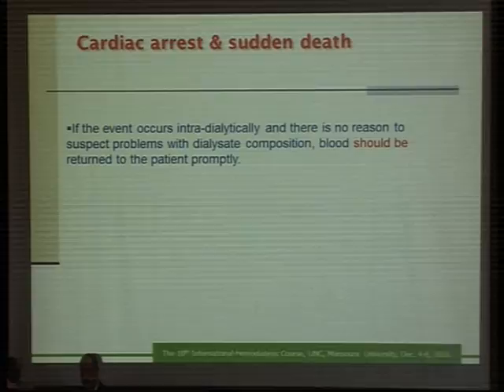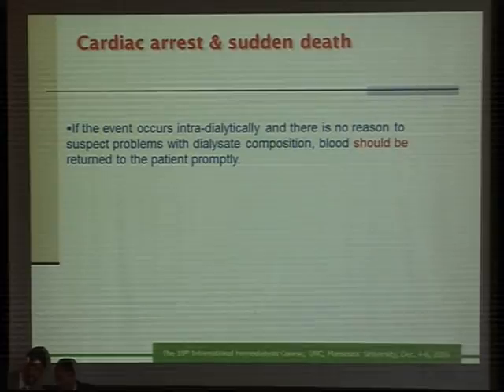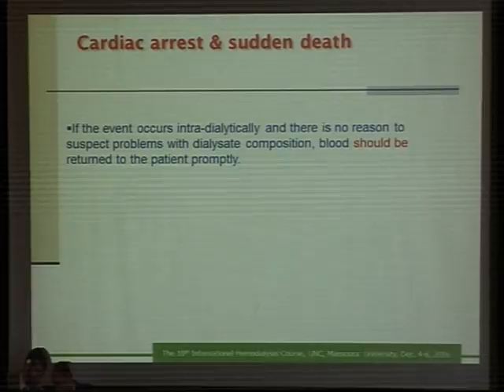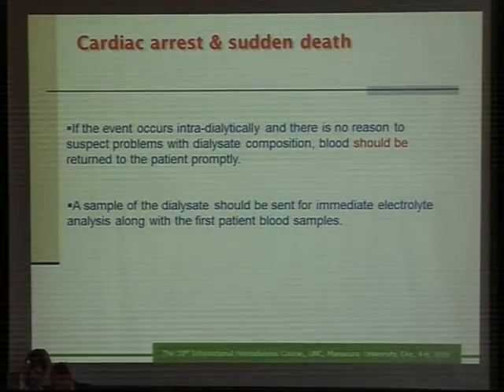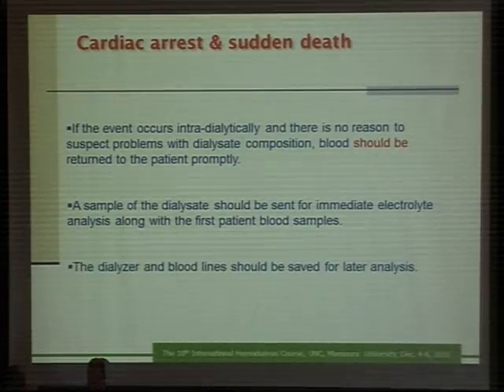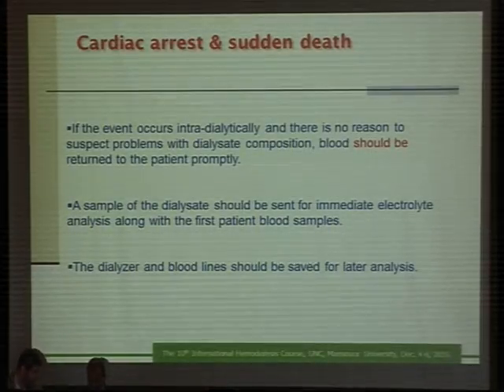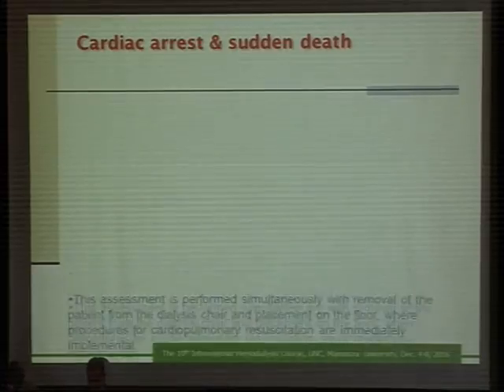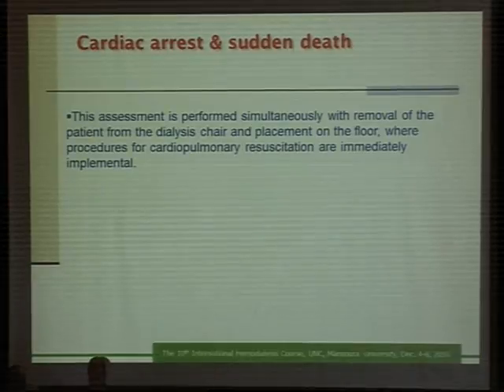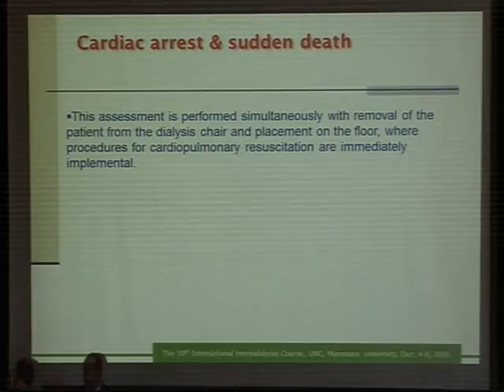And if the event occurs intradialytically and there is no reason to suspect problems, blood should be returned to the patient promptly and a sample from the dialysate sent for analysis. Dialyzer and bloodline should be saved for later analysis. This assessment occurs simultaneously with starting the cardiopulmonary resuscitation.